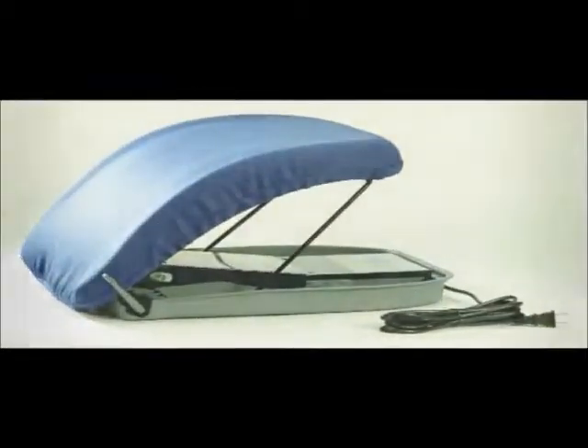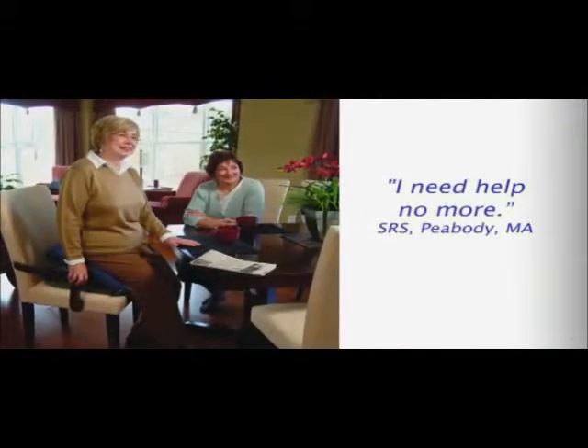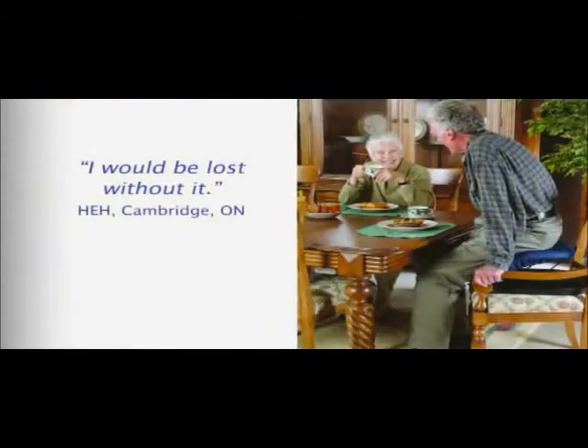Compact and versatile, the PowerSeat instantly transforms almost any armchair or sofa into a helpful mobility aid. Why struggle with pain and strain from sitting down or fighting to get up when there is a better way?